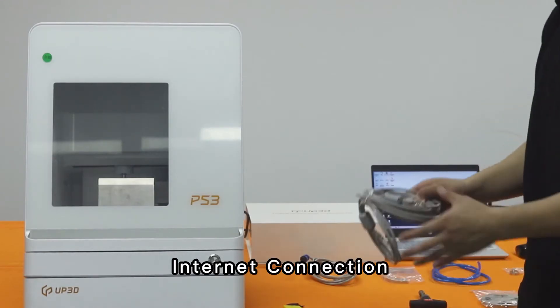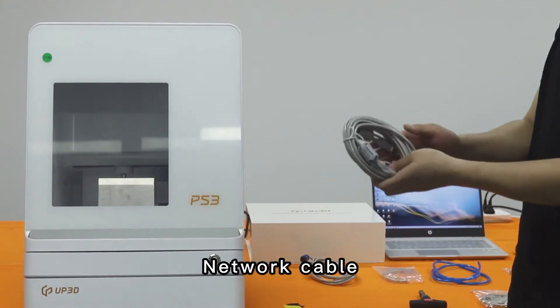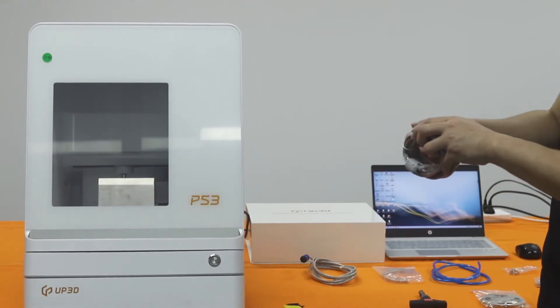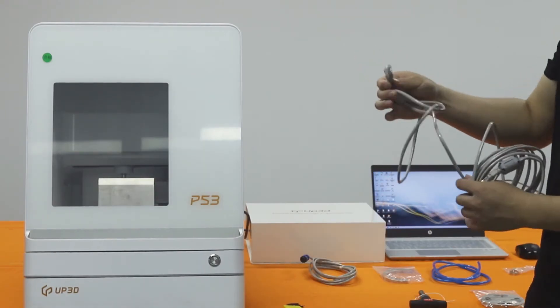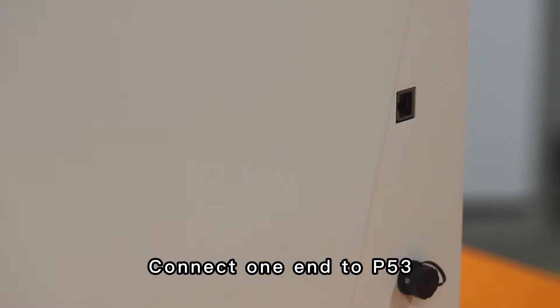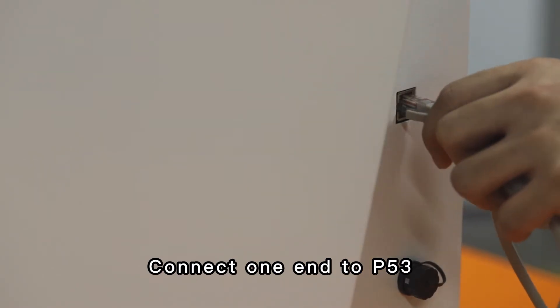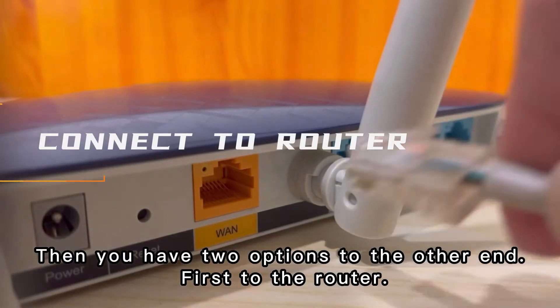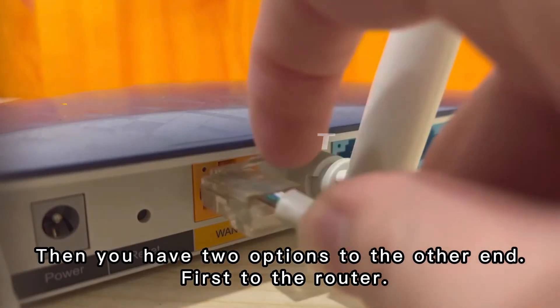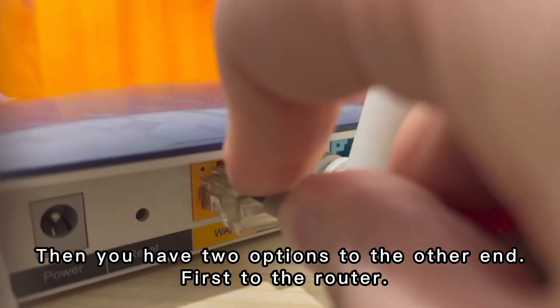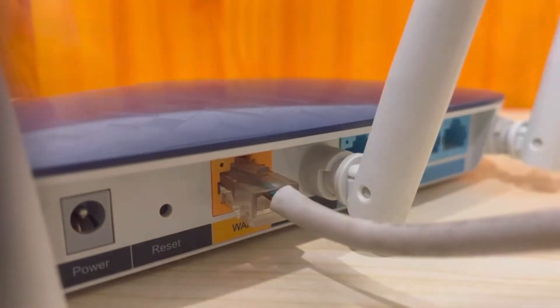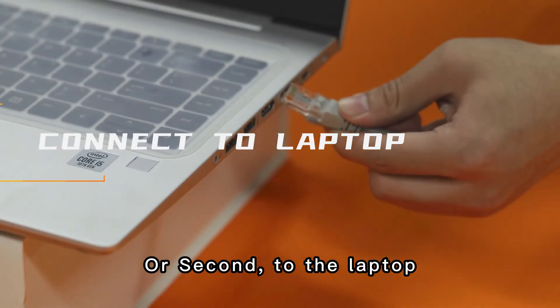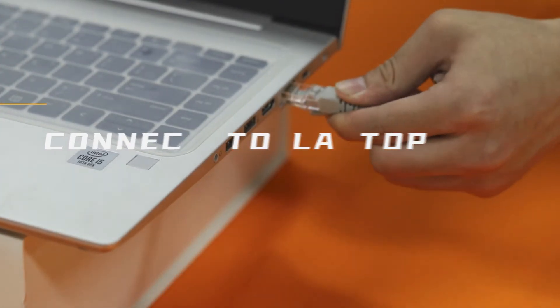Internet connection: Network cable. Connect one end to P53. Then you have two options for the other end. First, to the router. Or second, to the laptop.